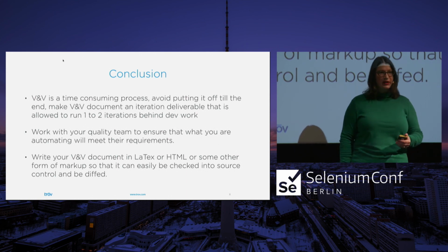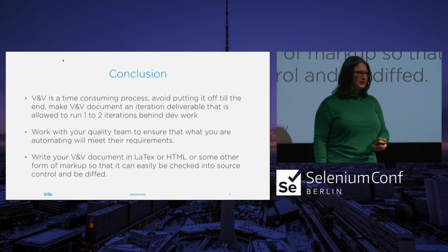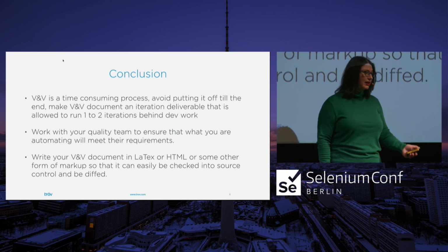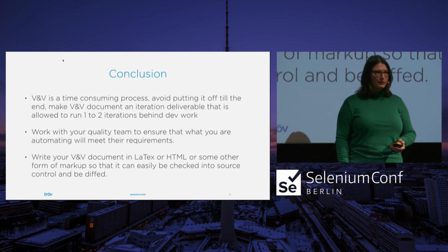In general, I can say it was very interesting to test medical devices. It was a lot of fun. It was an interesting process. It was a lot of work. If I were to do it again, like I said, I would make a lot of changes in how we did that. I would start early. I would be really clear with my quality management team.